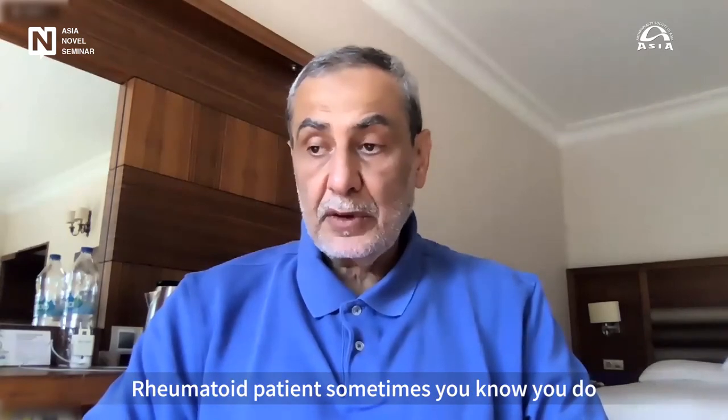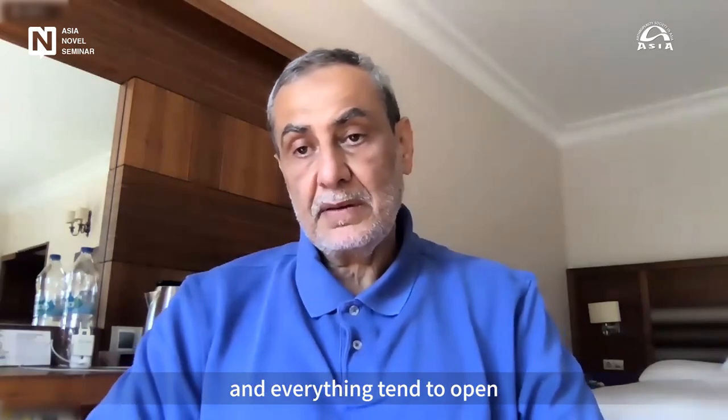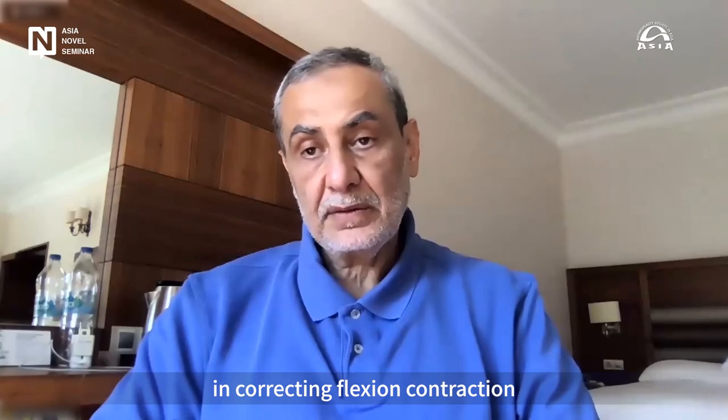Yes, you're right. In rheumatoid patients sometimes you do some limited release or capsulectomy and everything tends to open. Females tend to be easier than males in correcting flexion contracture.